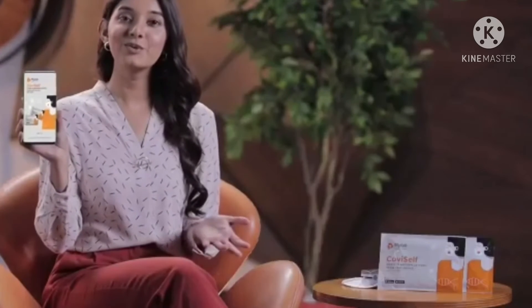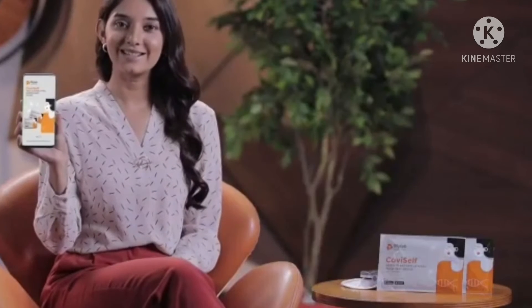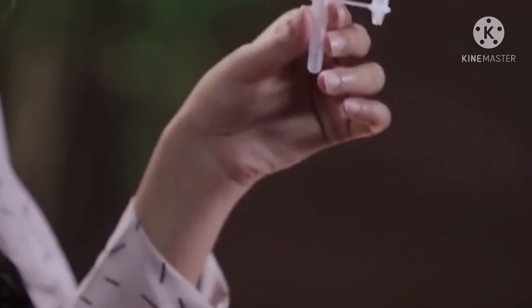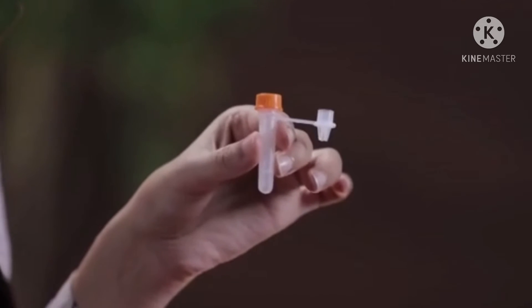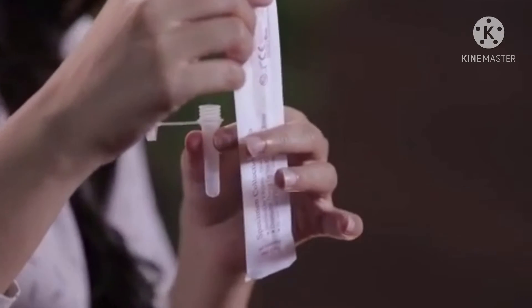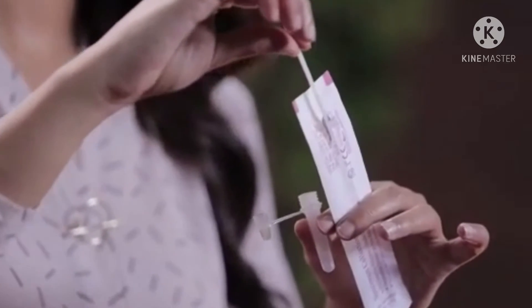Before you test it, you can download the app on mobile. Once you have the solution, you can tap the cap, then unscrew it and open it.